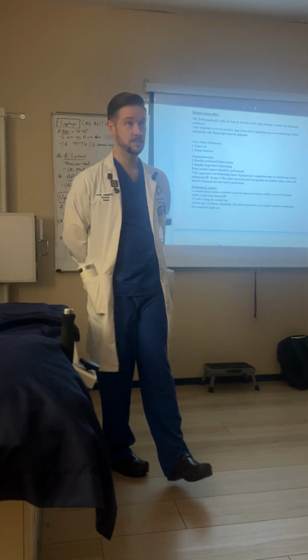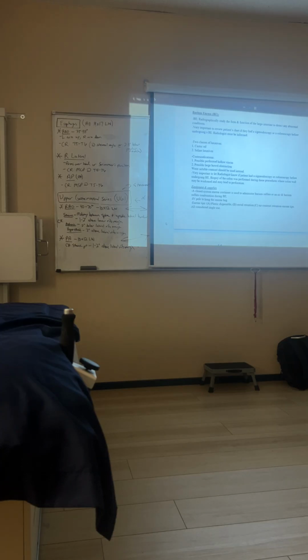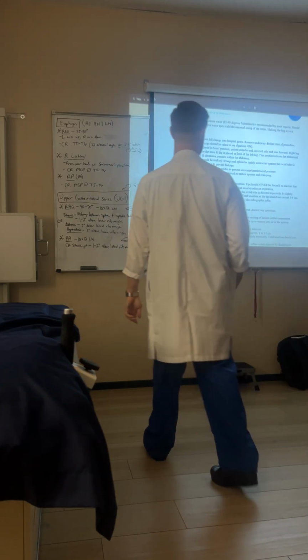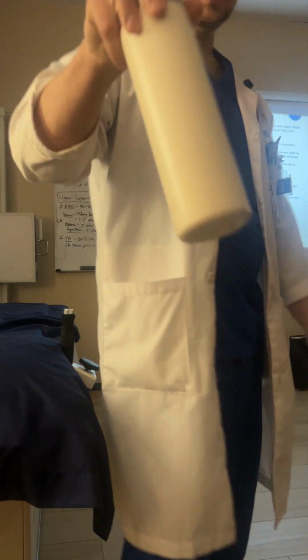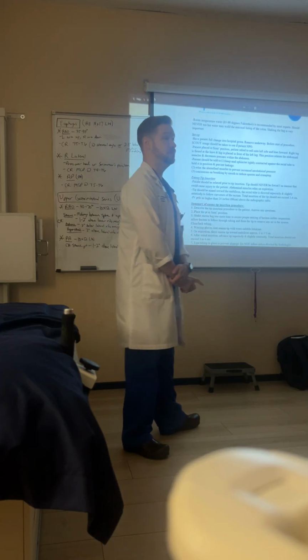For the insertion of the tip, this is the most involved, or one of the most involved procedures that we do in fluoroscopy. When you're preparing this, when you're mixing up your barium, you want to use room temperature water or just a little warmer. Never use hot water. A lot of people like to drink their coffee. They don't want it as an enema. So we're never going to use hot water, room temperature, or maybe just a little warmer because we don't want to scald the mucosa.